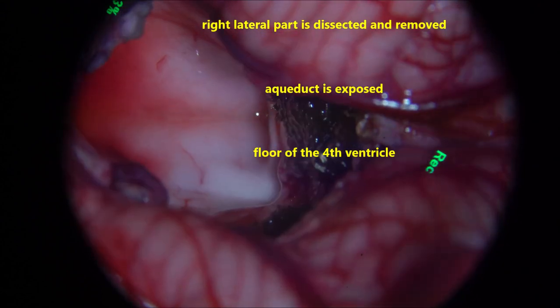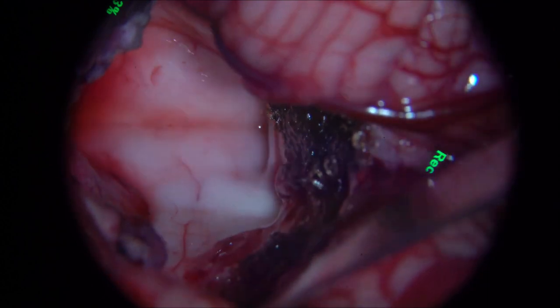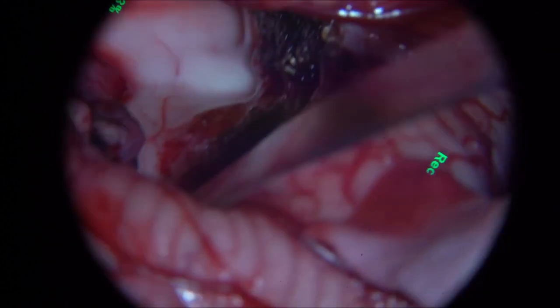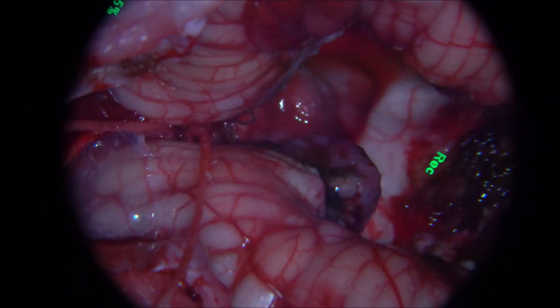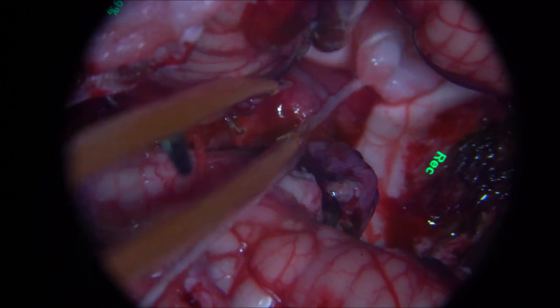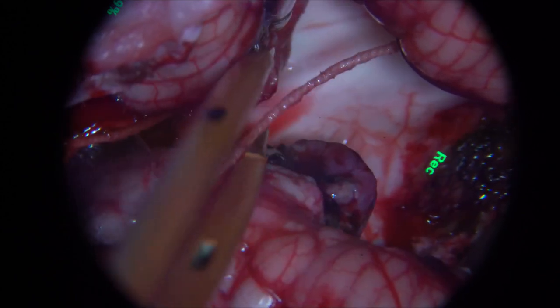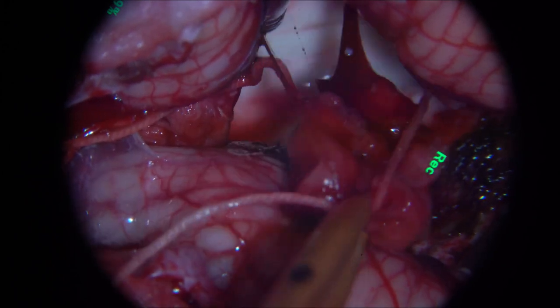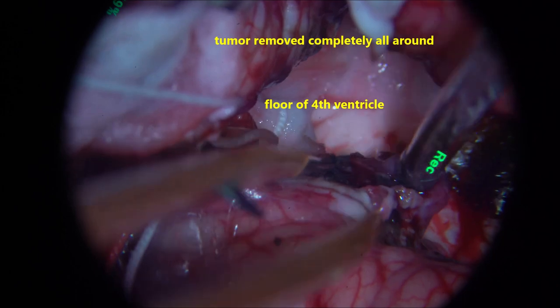The part is covered with Surgicel. One thing one must remember: unless you excise these lesions completely, bleeding will not stop. Once you excise the lesions completely, bleeding will stop automatically without needing to achieve hemostasis forcibly. That is the beauty of surgical resection when remaining in the arachnoidal plane.